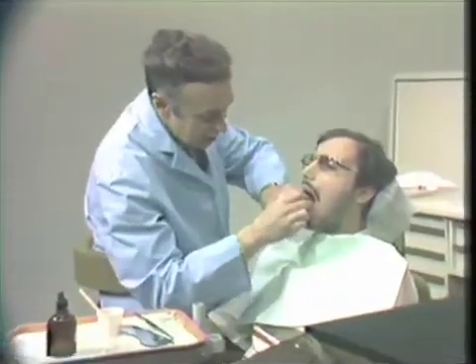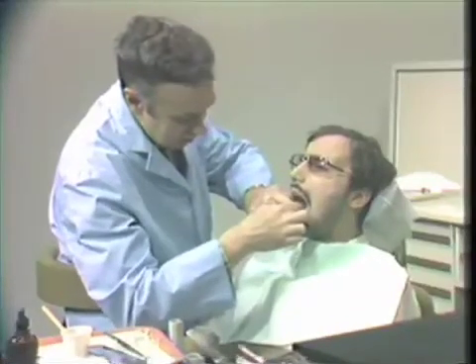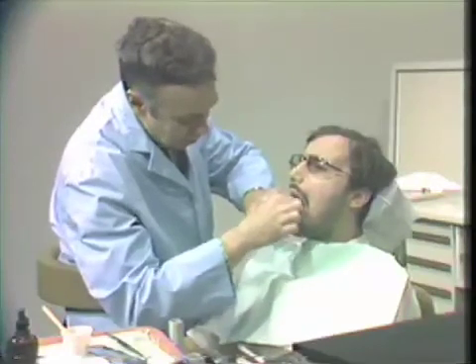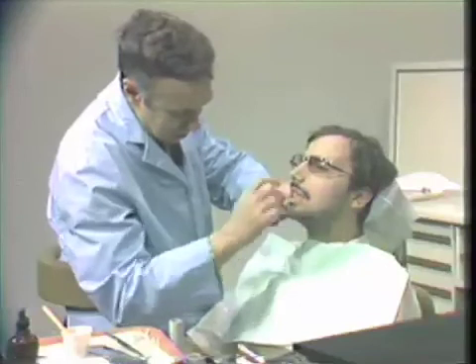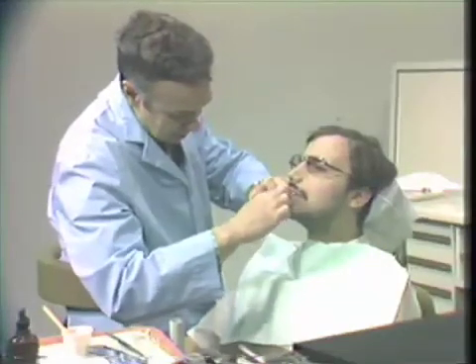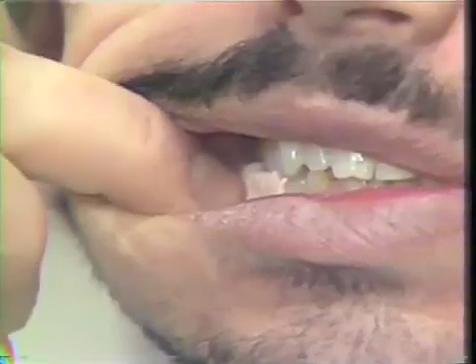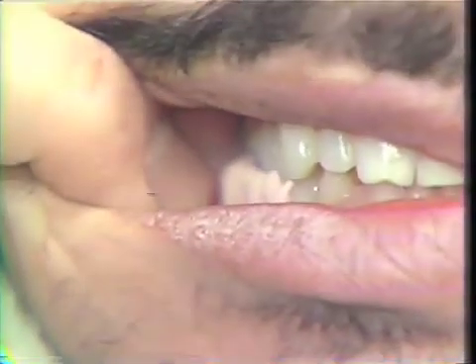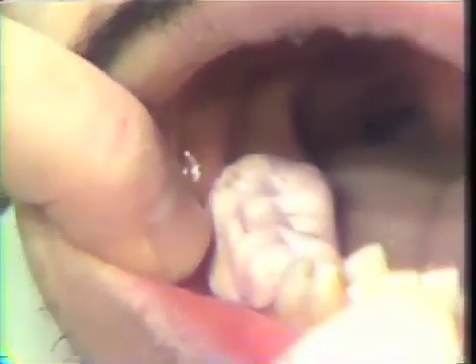And as we demonstrated in our laboratory exercise, we can set this to place and mold it down over the teeth. Now, close together, please. Have the patient close together. In this instance, in centric occlusion, we'll allow this material to attain a little more substantial body to it, and then we'll remove it and replace it several times until it starts to go through its polymerization.